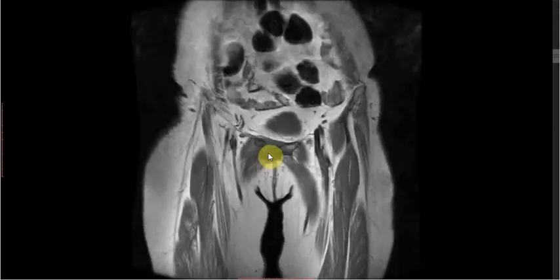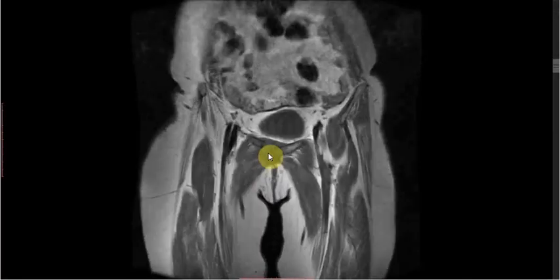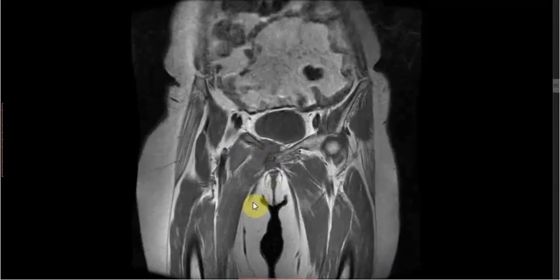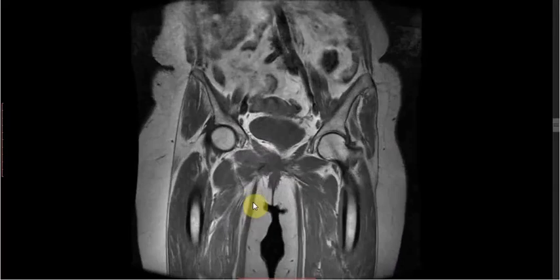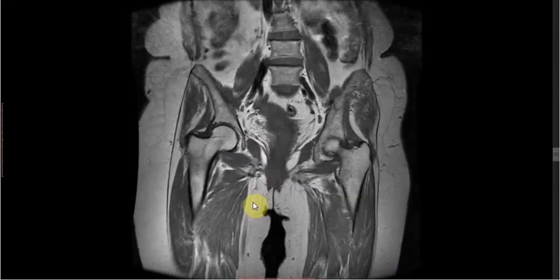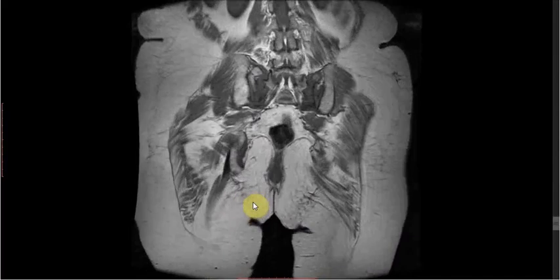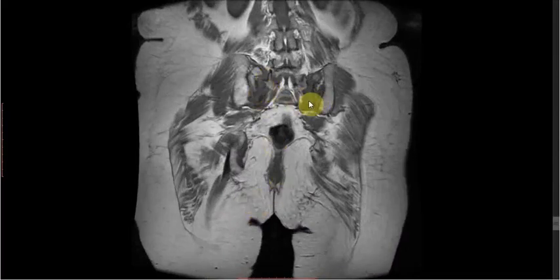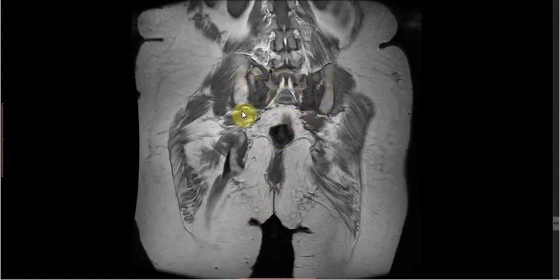On the coronal T1-weighted sequence, we can see there is presence of a displaced fracture in the right superior and inferior pubic ramus, and there is presence of bilateral vertical fractures involving the sacral ala, which are parallel to the bilateral sacroiliac joints.